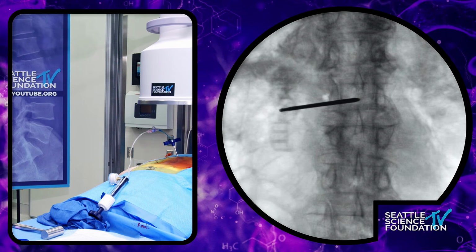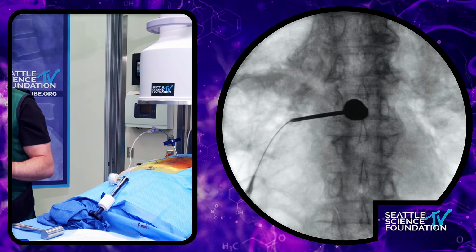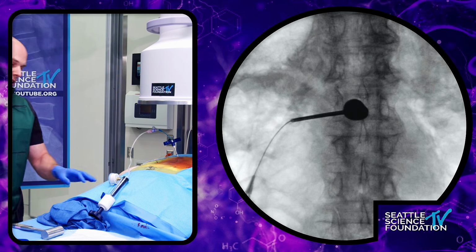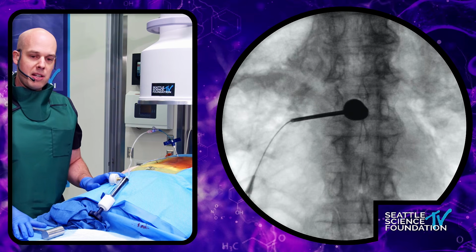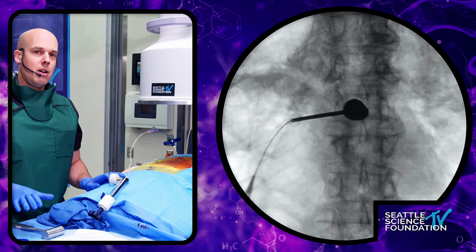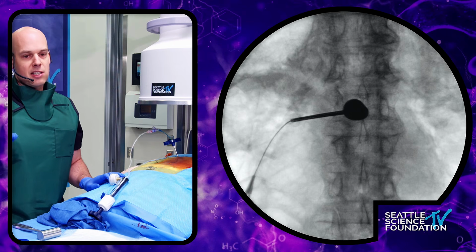And now we're prepping some cement here. That's great. Right now they're prepping the bone fillers. This is a special cement called Vertifix HV. It is a cement that has interesting characteristics that are a little bit different from other acrylic type cement. It contains tracking beads inside.